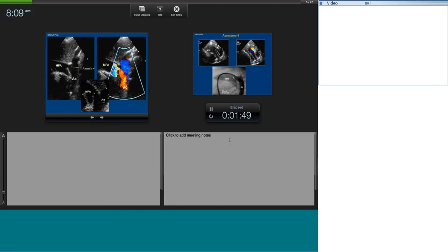In the ductal view, with the probe in the first intercostal space and the pointer at 12 o'clock, you see anteriorly the main pulmonary artery, the descending aorta, and the ampulla of the duct. With minor adjustments you see the pulmonary artery insertion of the duct, and you can measure it accurately. This allows you to decide the modality of closure, the device to use, its size, and whether cath lab closure is feasible.